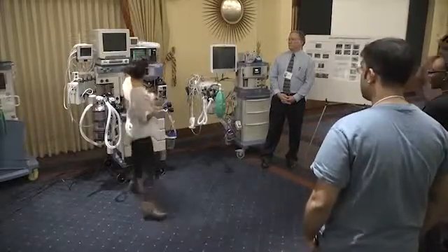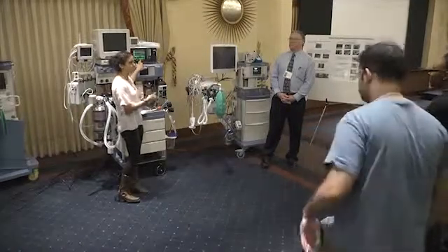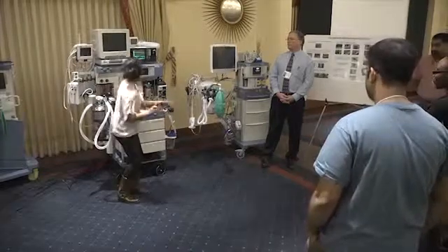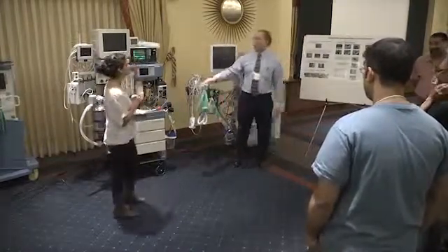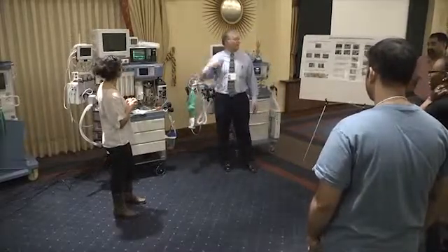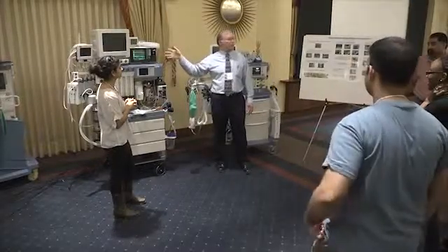But as you can see, it's still calibrating, and this feels like an eternity when the nurses, surgeons, residents, everyone is just watching you, and everyone's watching this damn thing, waiting for it. And the other thing is, you have this expectation that it's going to work. That's not mine, because when I turn this on, until I see that, I actually don't think it will work.